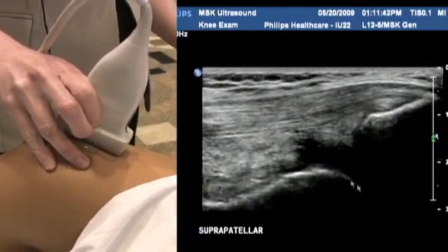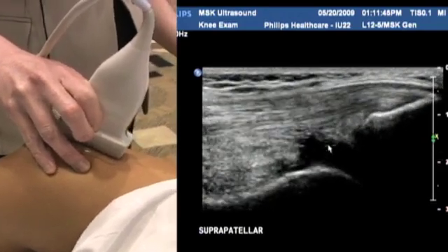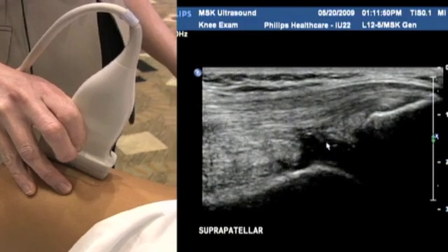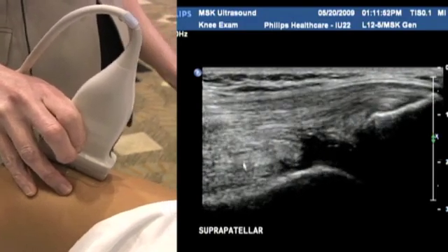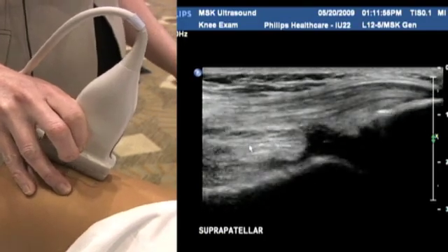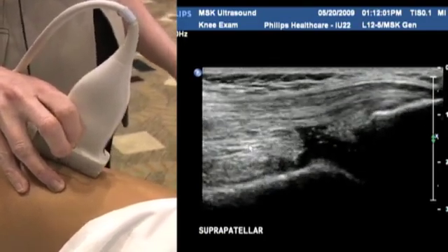You'll see below in the suprapatellar fossa, there's a small amount of fluid here, and that's quite normal. Most people have a little bit of fluid. When it gets an excessive amount, say we're sort of starting to get to this level, that would be called a suprapatellar effusion, and that's certainly something that ultrasound can guide a needle to drain.